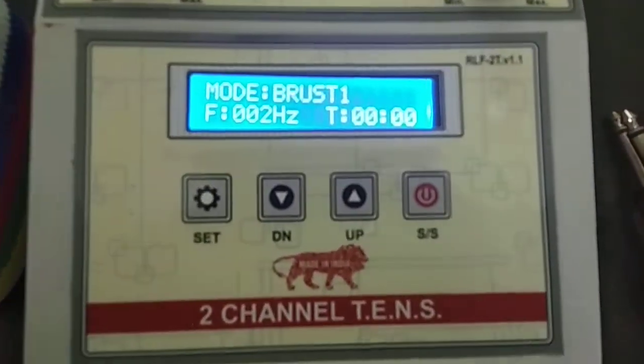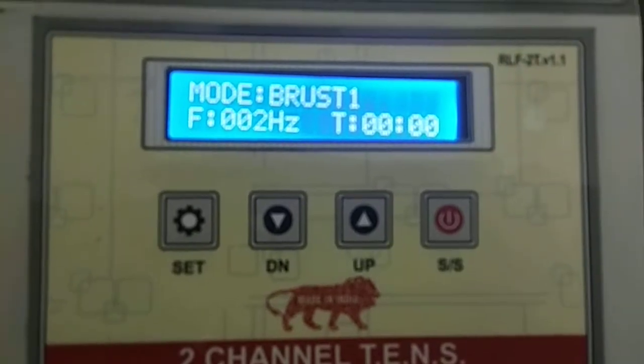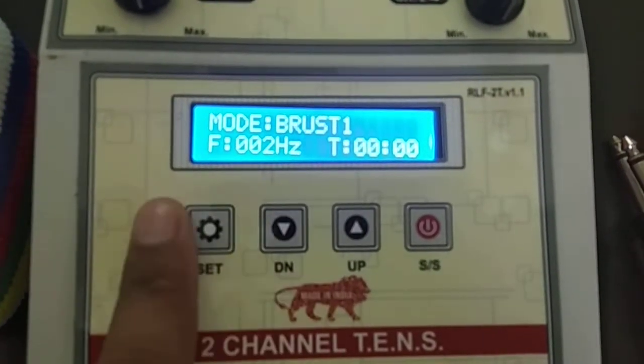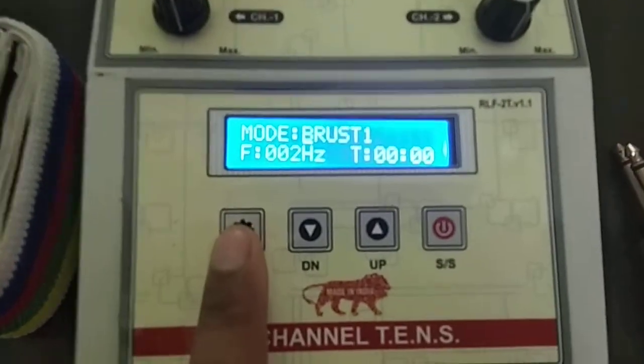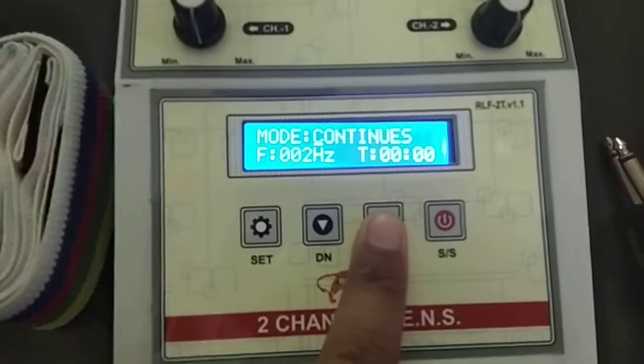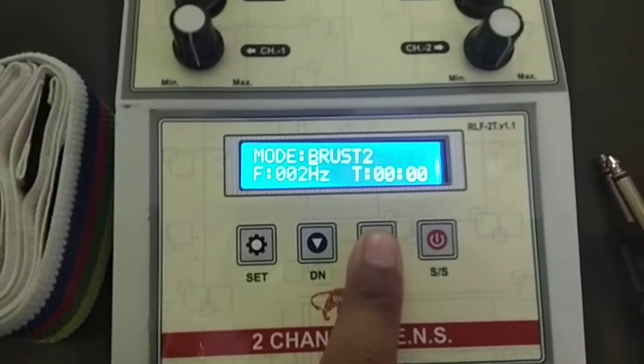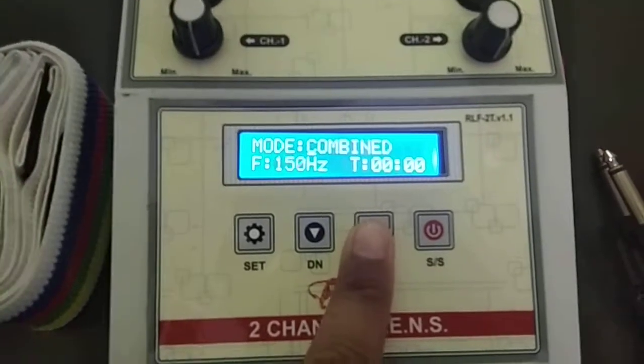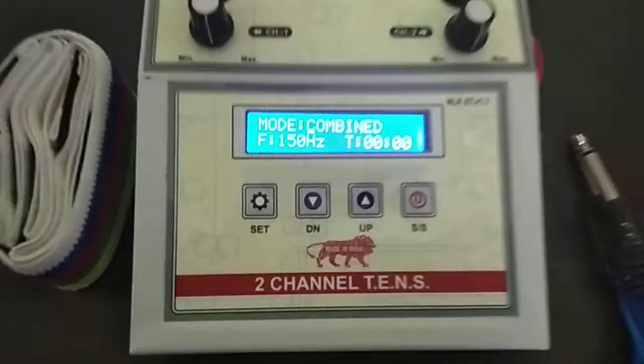Now the device is switched on. There are 6 programs: burst 1, continuous, burst 2, PWM, sweep, and combination, that is called combined.